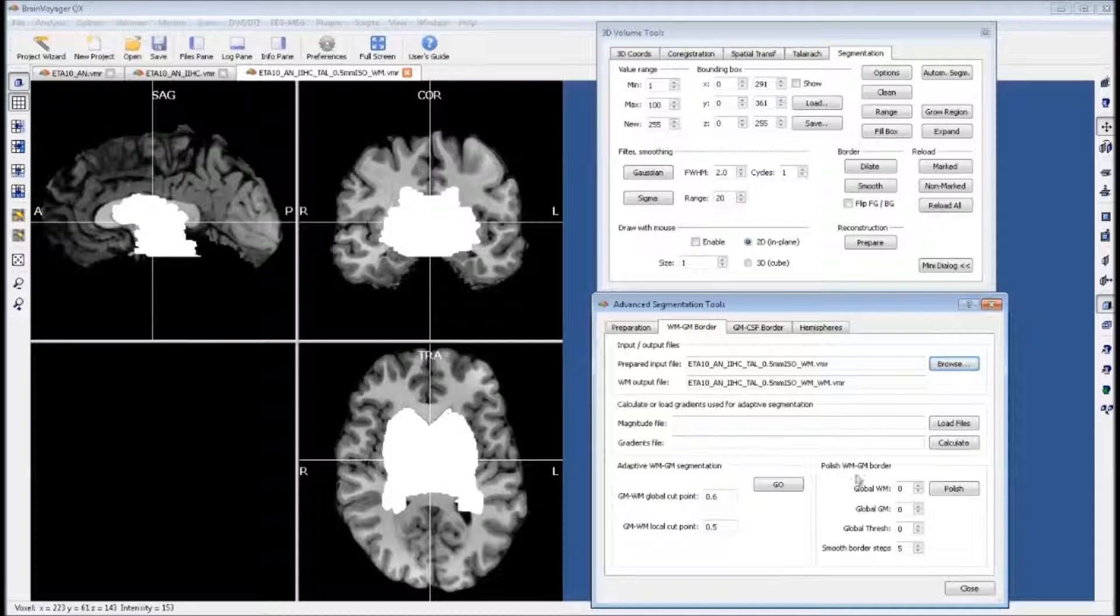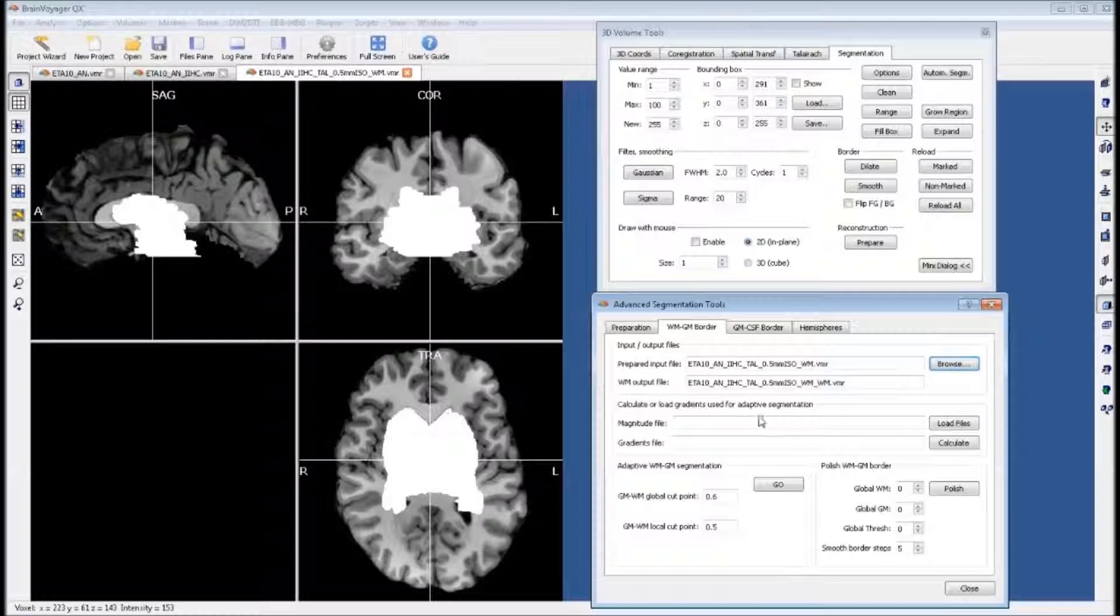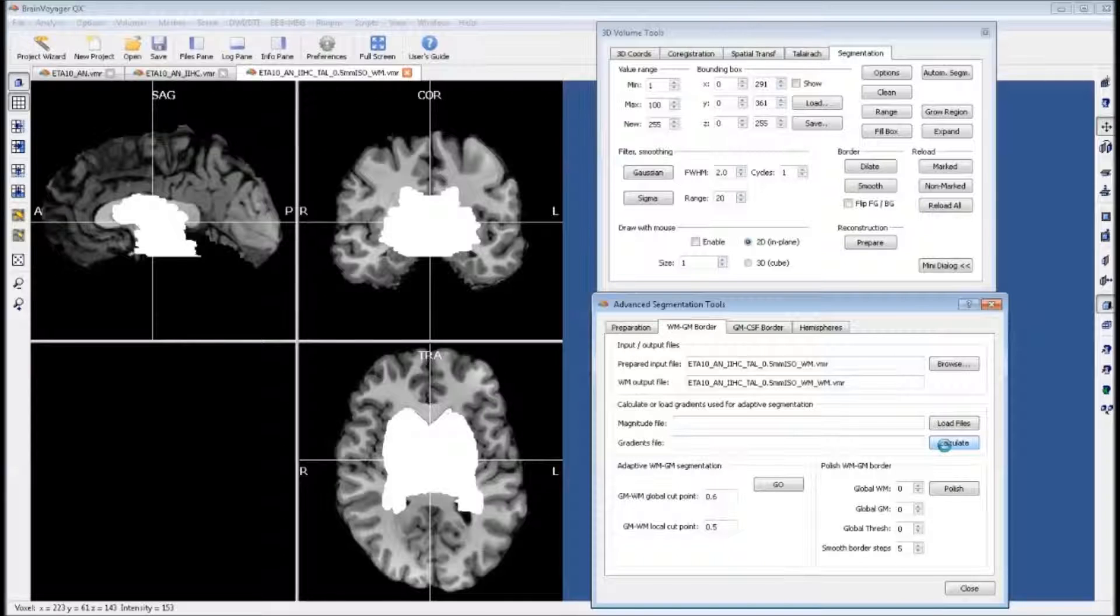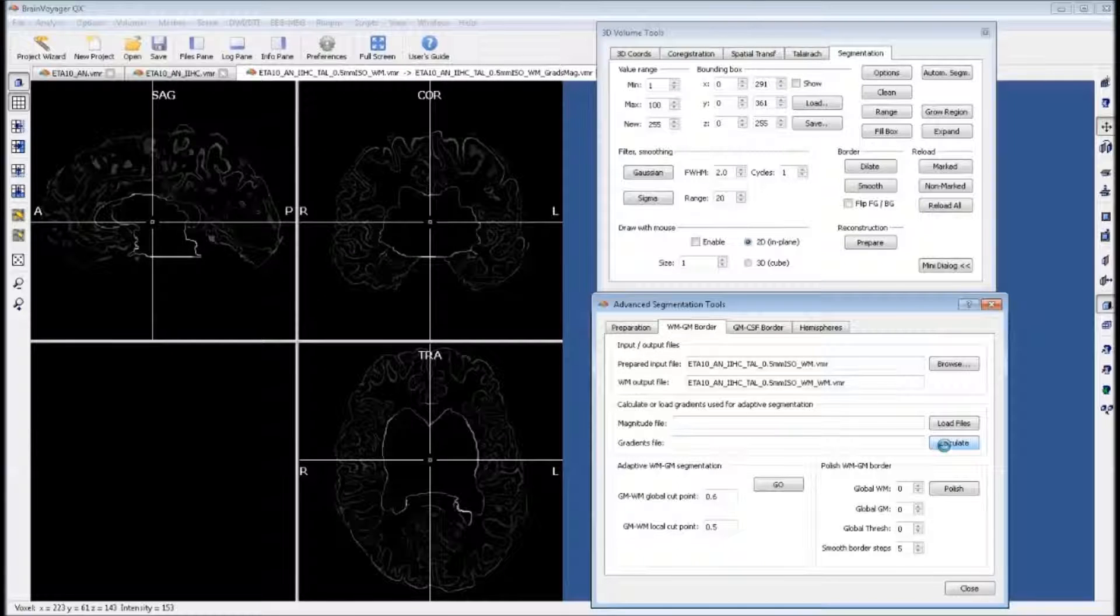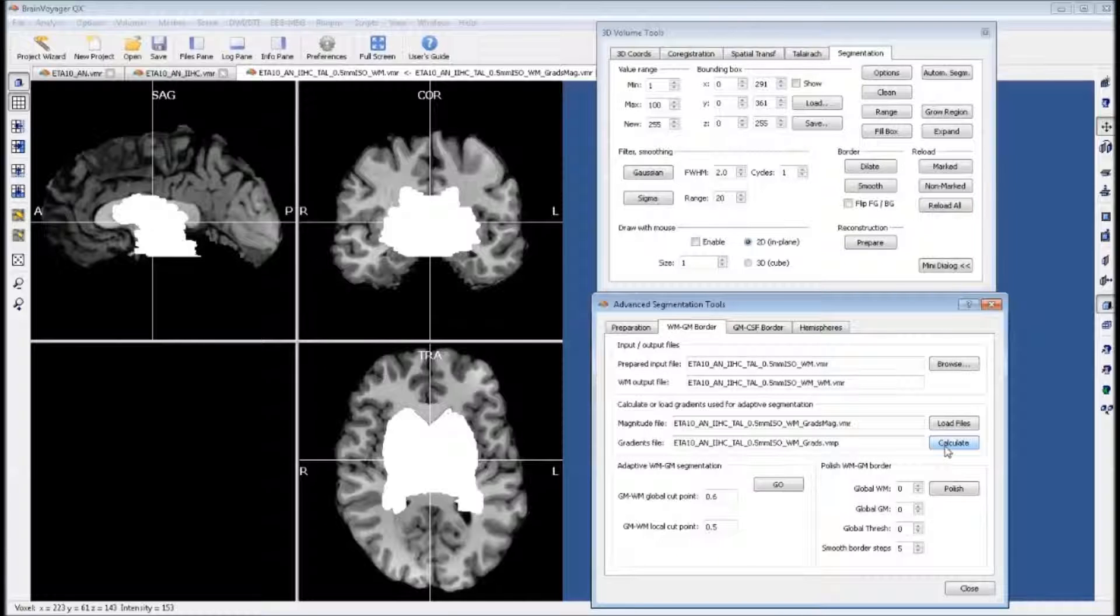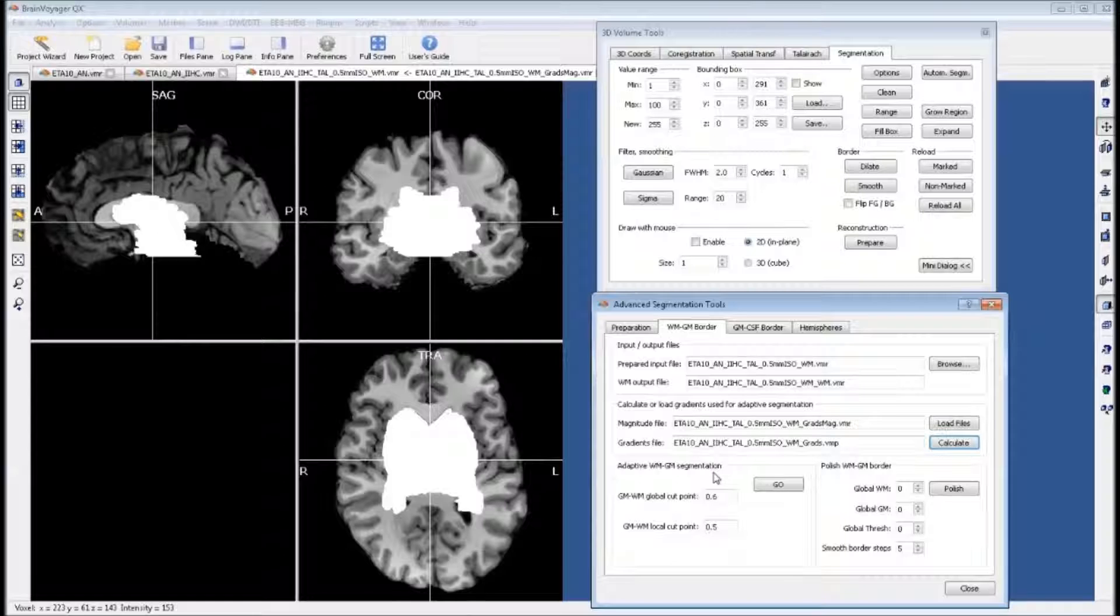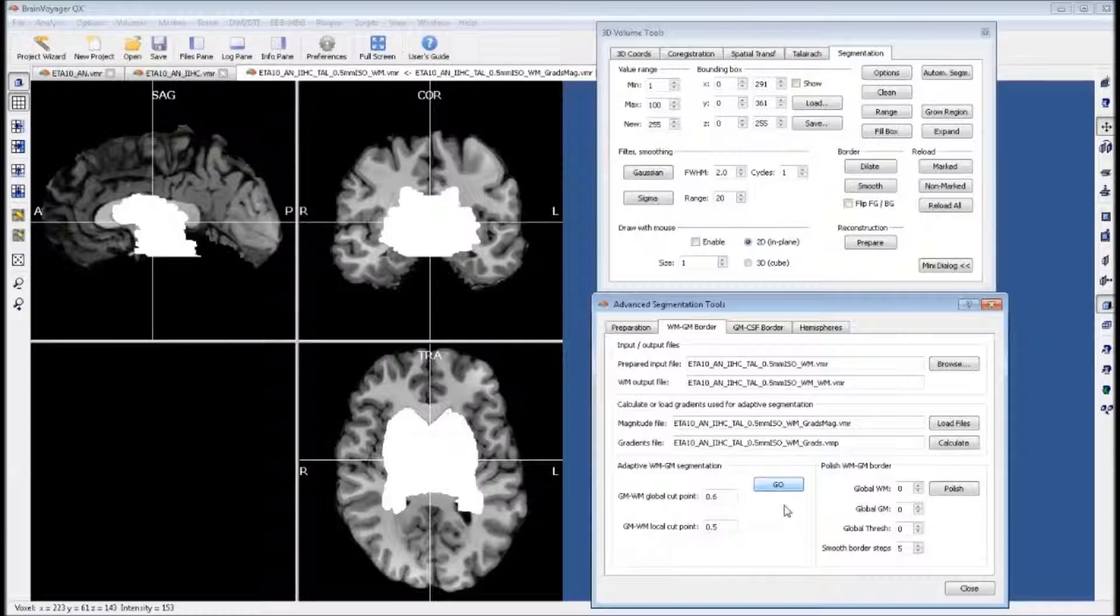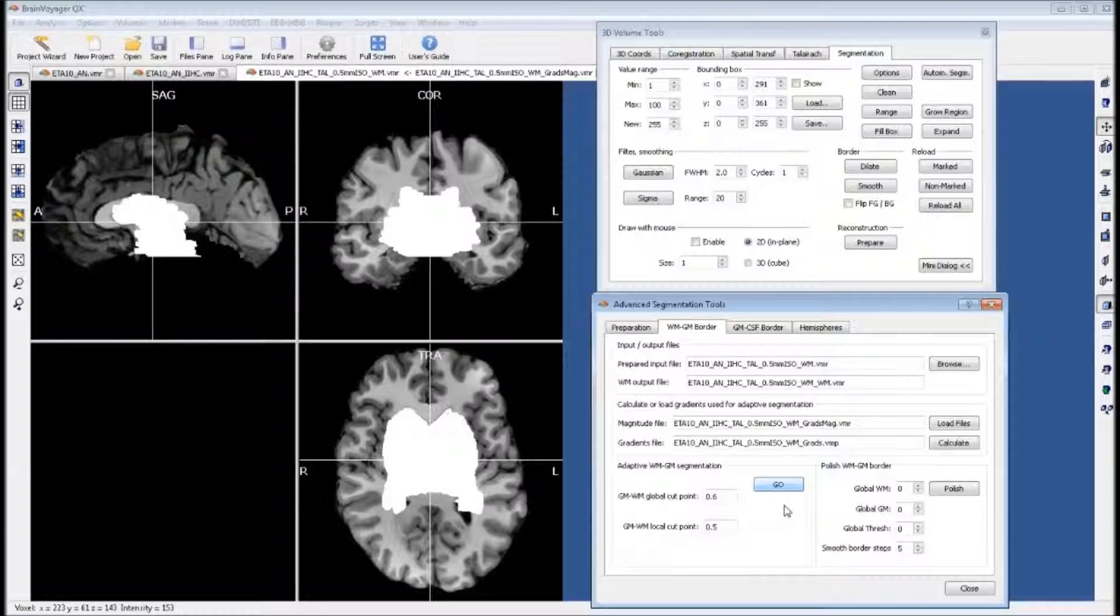We can go to our white matter, gray matter border tab. To do segmentation Brain Voyager needs to calculate these magnitude and gradient files. Once these are calculated, they're saved. We can now go to our segmentation part of this tab. The defaults here are typically fine. We can hit go, and what it will do is it will try to color in the white matter with a blue coloring.